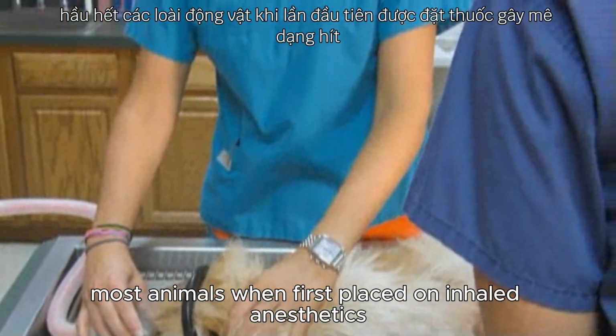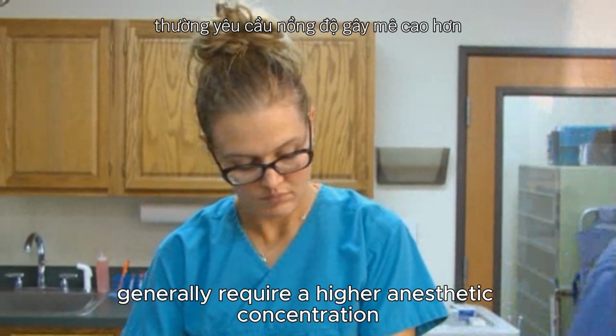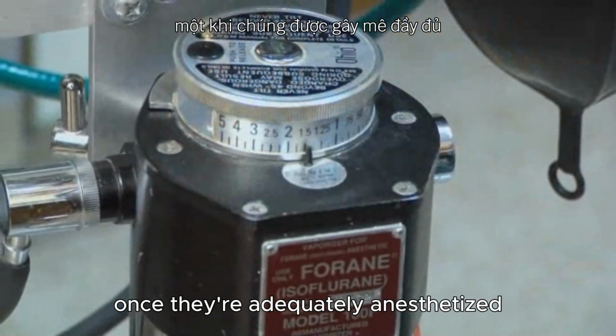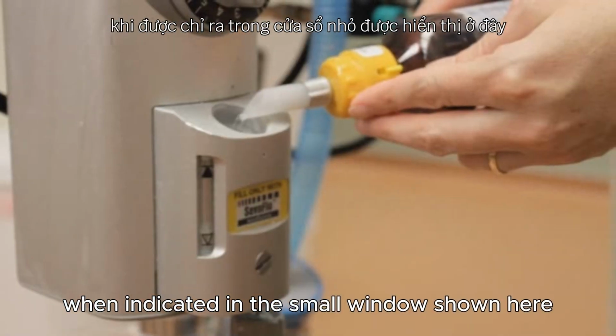The vaporizer is the critical component of the anesthetic machine used to control the patient's level of consciousness or depth of anesthesia, and will need to be frequently checked throughout the anesthetic process. Most animals, when first placed on inhaled anesthetics, generally require a higher anesthetic concentration, but the vaporizer can then be adjusted to a lower setting once they're adequately anesthetized. The vaporizer will need to be periodically refilled when indicated in the small window shown here.